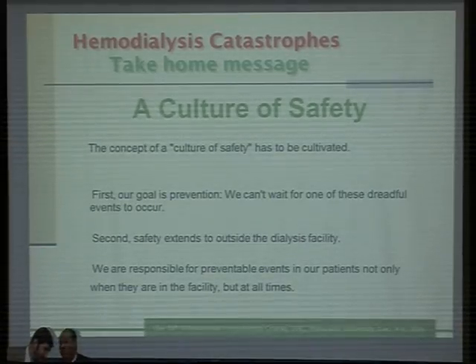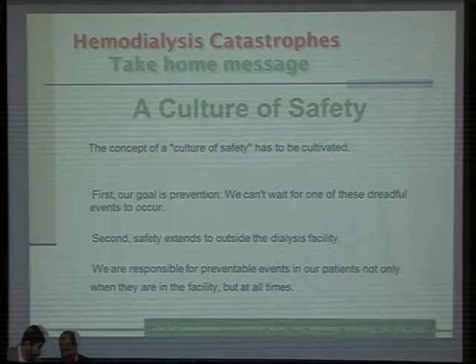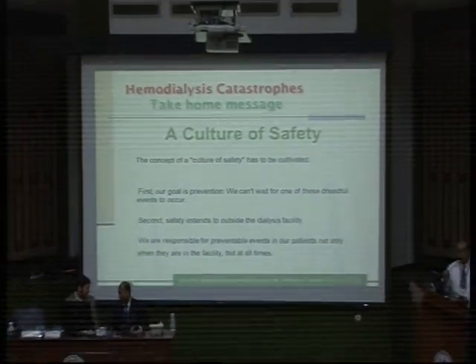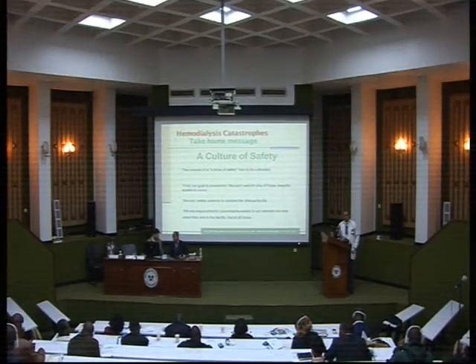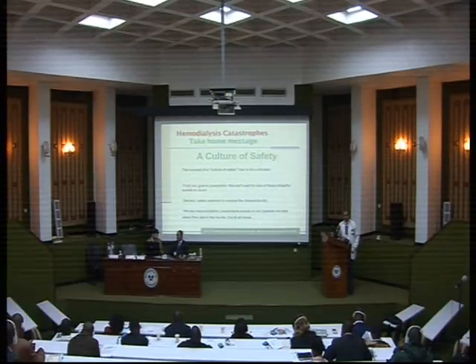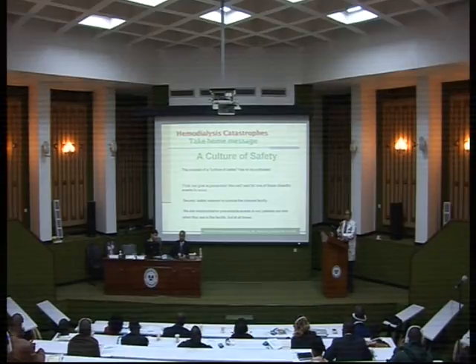So every nephrologist, when he comes back to his unit, must prepare two very important things. First, a manual of hemodialysis complications, and second, policies and procedures for every aspect in hemodialysis. Totally agree with Professor Samir. These are two very important points.